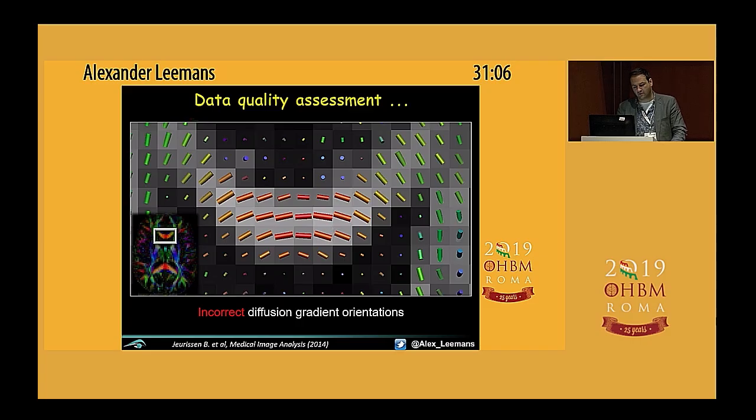And you have to keep in mind with diffusion MRI, you're looking basically at two coordinate systems. We've got our spatial coordinate system, right? The way our head is positioned in the scanner. But if you're doing an eigenvalue decomposition to get information about the ellipsoid, like shape and orientation, then that information is also in its own coordinate system. That's basically what a principal component analysis and an eigenvalue decomposition is all about. You're changing your coordinate system such that the variance is minimized, or maximized along the axis, along your new coordinate system.